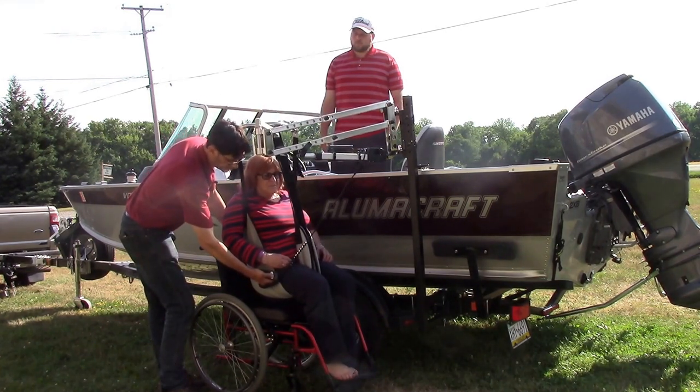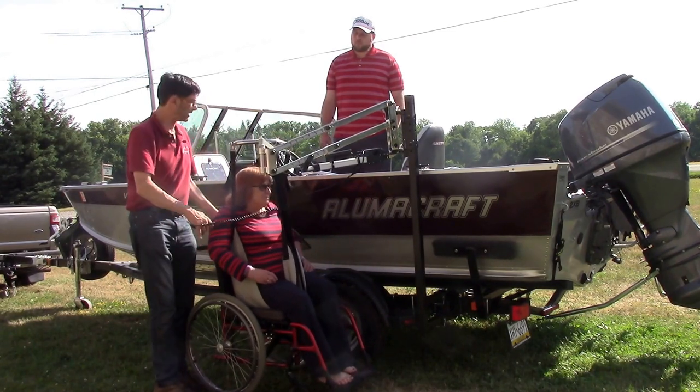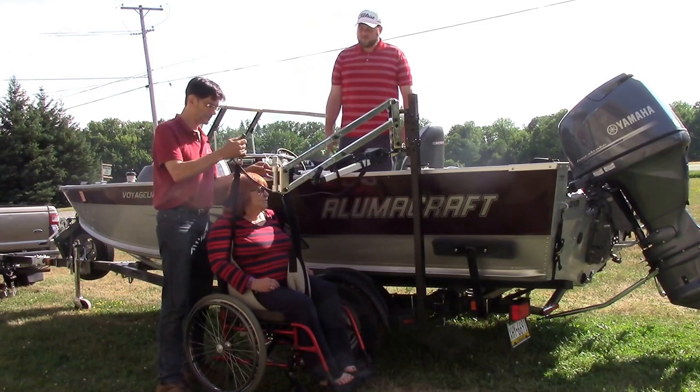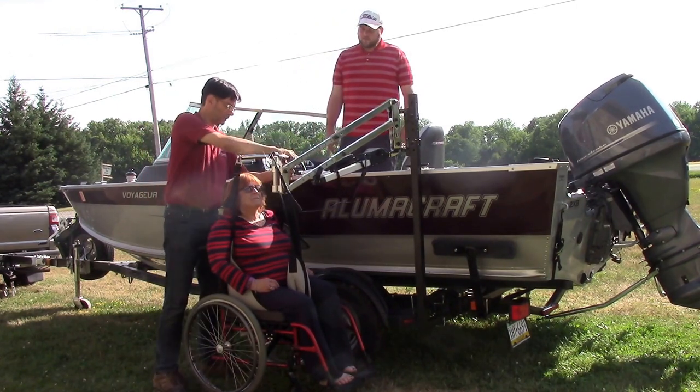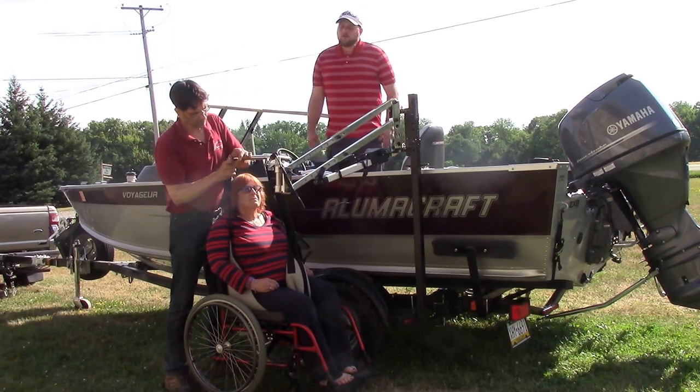You can also put a mount on the transom of a boat, and sometimes we've even seen people put it on the deck of the boat inside with a removable post. You can also have it on the side of the hull. Lots of different options to give you access to almost any kind of boat.